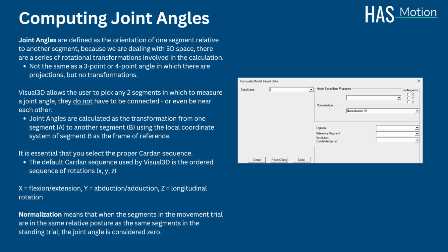Visual 3D lets you pick any two segments in which to measure a joint angle. They do not have to be connected or even be near each other. In practice, joint angles are calculated as the transformation from one segment A to another segment B using the local coordinate system of segment B as the frame of reference. It is essential that you select the proper Cardan sequence based on a complete understanding of what you are trying to measure. In Visual 3D, you can select the Cardan sequence that you want, which relates to your specific data.